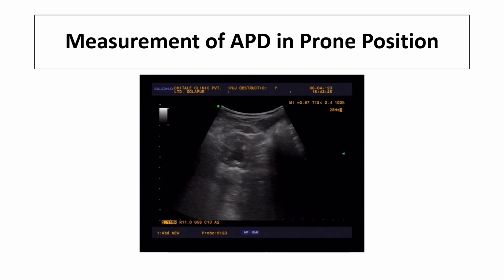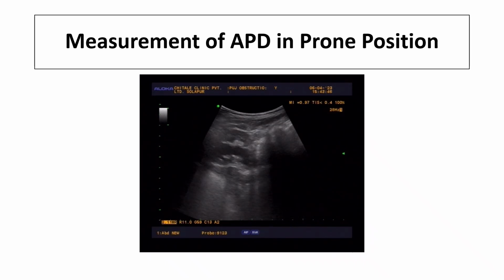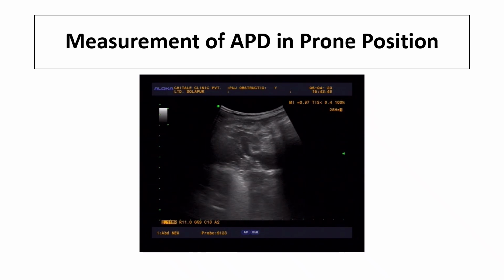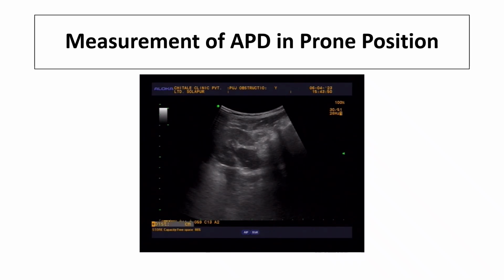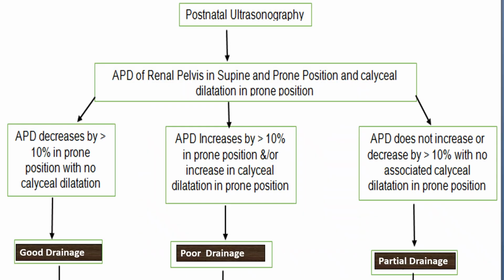and then compare it with the same parameter in prone position, and measure it the same way in the prone position, just as shown here, then we can come across 3 different scenarios.